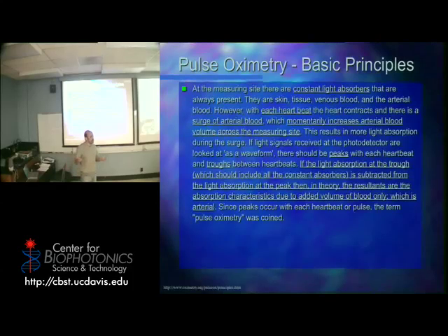How did they originally calibrate this system? The volunteer, aka sucker, is there with a device on their finger measuring the light constantly, and on the other side somebody was taking their blood, right? Or it might have even been from the same hand.